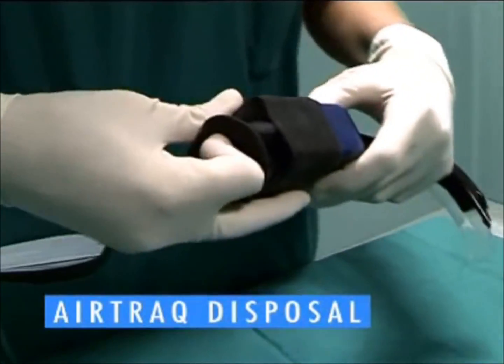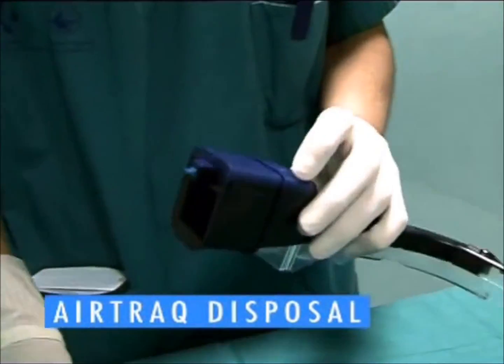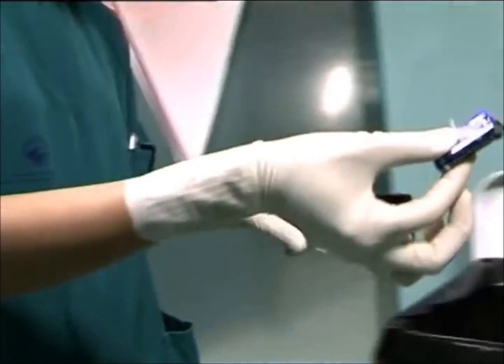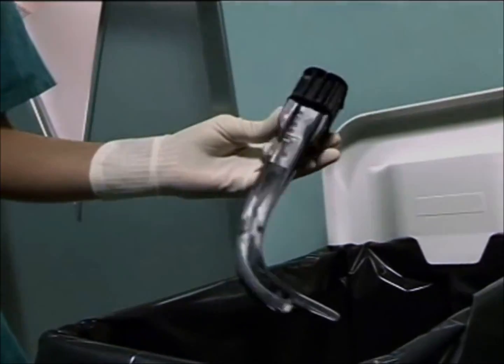Air-track is a single patient use device and should be disposed of after use. To remove the batteries, pull off the viewfinder cover, remove the battery cover and the batteries. Discard as per protocol. Dispose the remains of the air-track as standard contaminated medical waste.